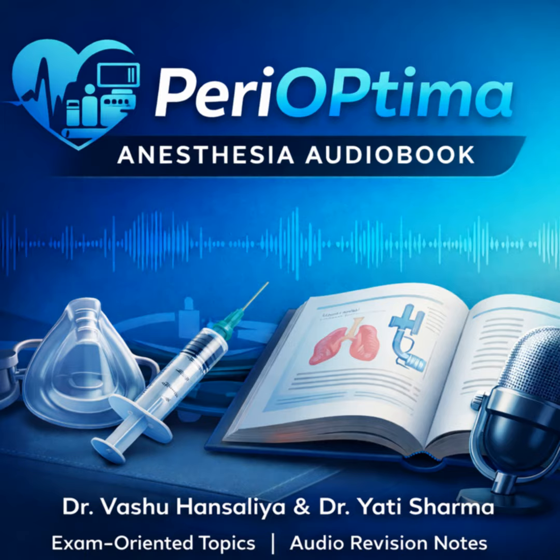Okay, finally, the meticulous equipment preparation checklist for FOI. Your difficult airway cart needs to be tailored. You want long, armored ETTs, the wire-reinforced ones that resist kinking. And you check the cuff? Always check the cuff. And remember, if you use a stylet, it needs to be straight, not hockey stick shaped. Check the FOB itself, light, angulation, suction. And the golden rule, have your alternative devices ready to go. VL and intubating LMA, suction, and the emergency surgical airway kit, physically marked.